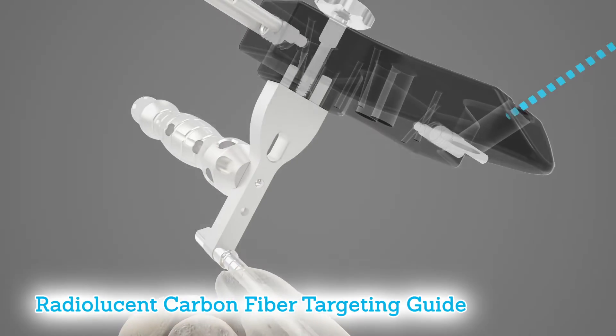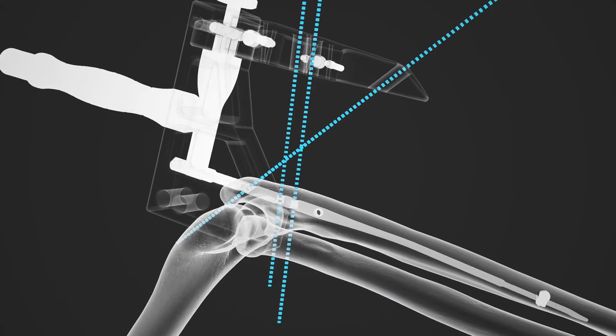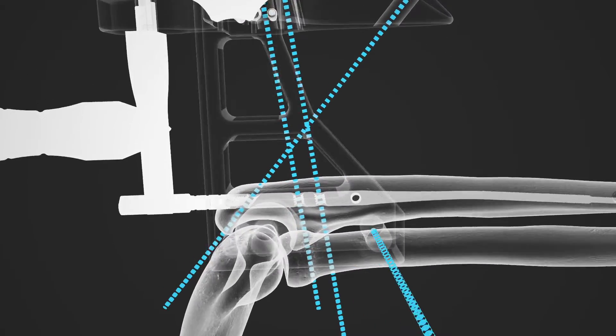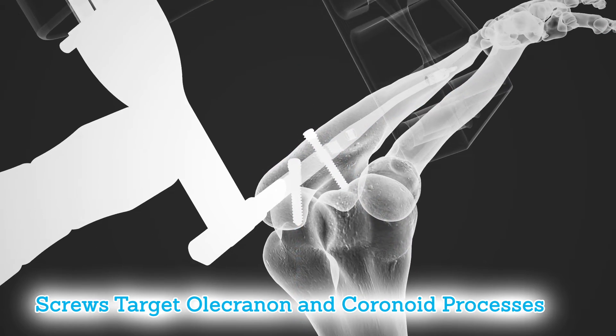The radiolucent carbon fiber targeting guide in the system is designed to aid in proper placement of interlocking screws in the nail, including screws intended to target the olecranon and coronoid processes.